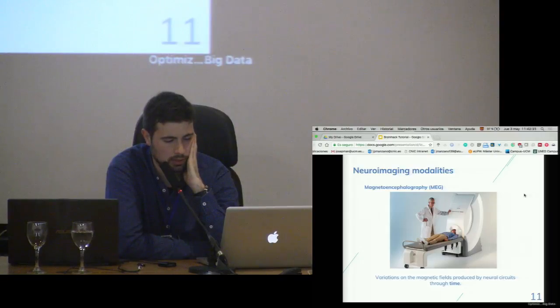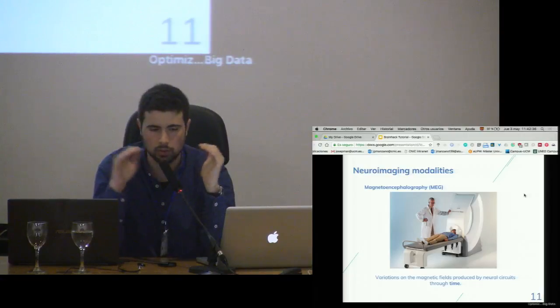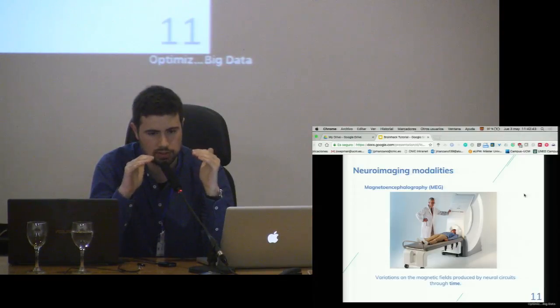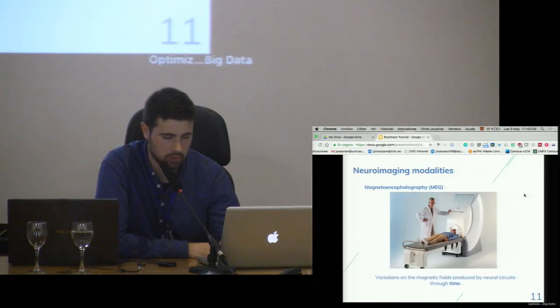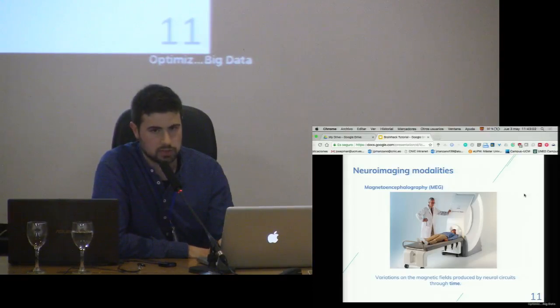And obviously, you have to place them inside rooms which are super isolated from the outside so that no magnetic field can enter. And even then, the signal that you get is not so relevant, and it's super difficult to analyze, in the sense that you might never know if it's really something happening in the brain right there, or just some noise that happened to be in the machine itself. It's interpreting the results. Obviously, this is an exaggeration. MEG can be really useful, but I just want you to understand that it's not something that's already solved.